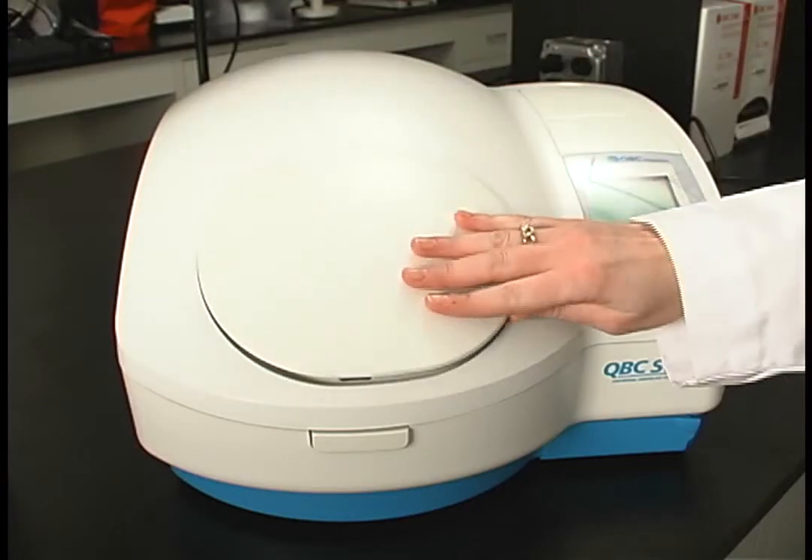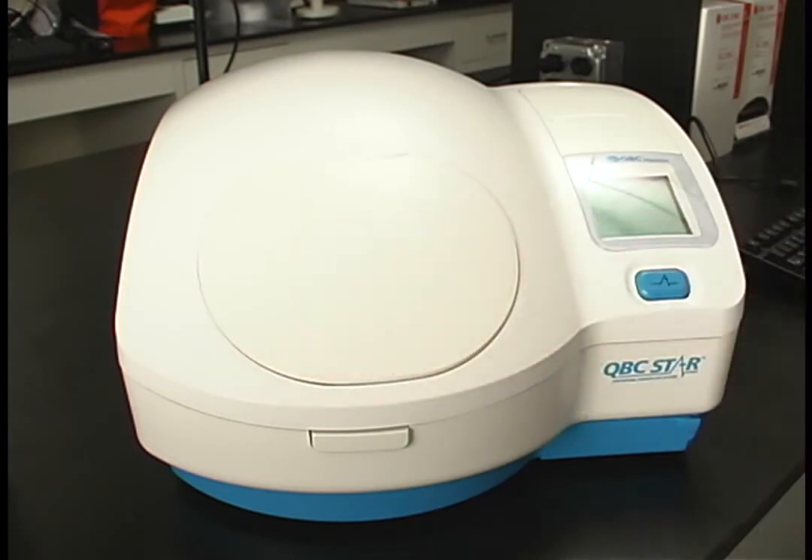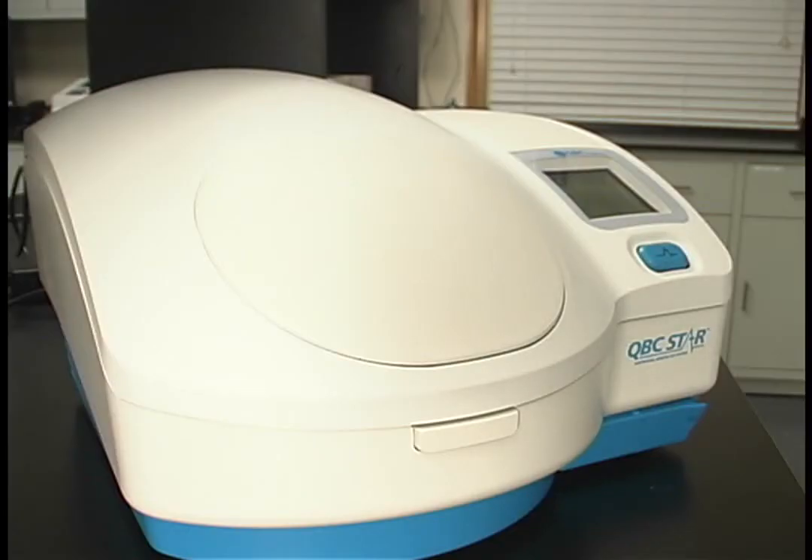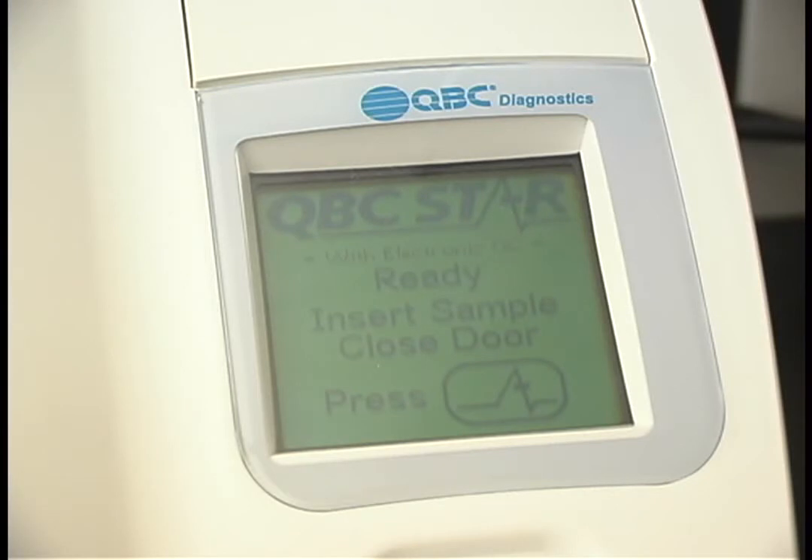At this time, the STAR performs an internal system check. It checks such things as the centrifuge motor and speed, optics, temperature, timing, and setup keypads. The test takes about two minutes. When the check is complete, the door will unlatch and the screen will indicate that it is ready for a sample. The STAR will also provide you with a printout of the system check.